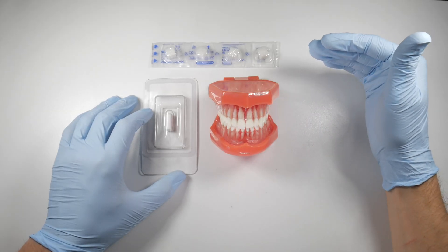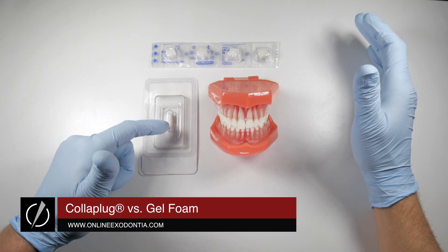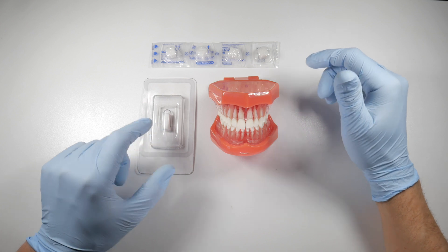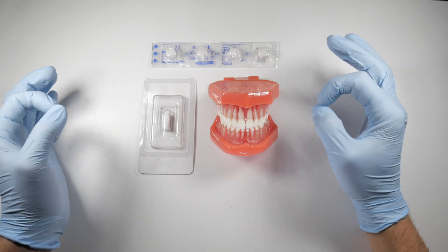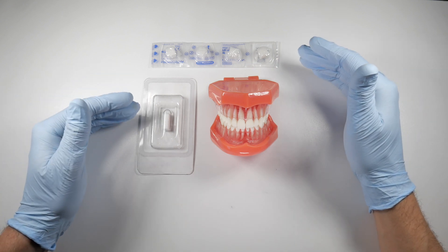Here are two examples of resorbable hemostatic agents that you could place into a socket after an extraction. This is a Collaplug, and these are gel foam sponges. If you have a bleed that's difficult to manage, or you're getting more bleeding than expected after an extraction — maybe the patient has a bleeding history or is taking blood thinners — then it may be a good indication to place one of these.